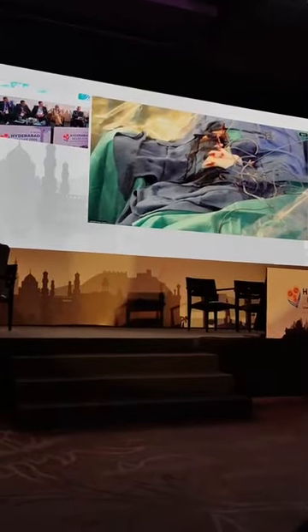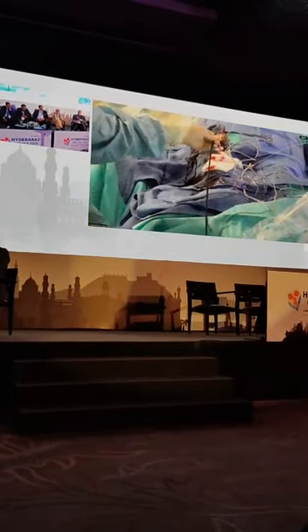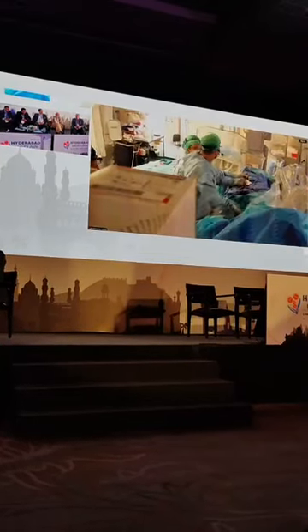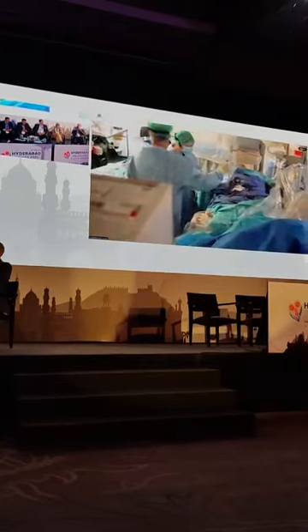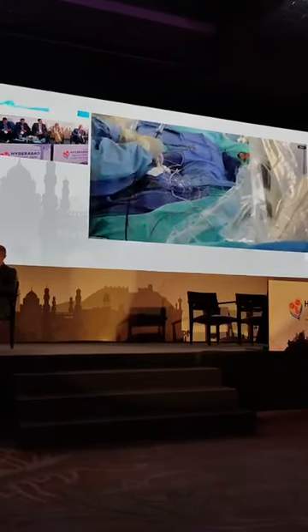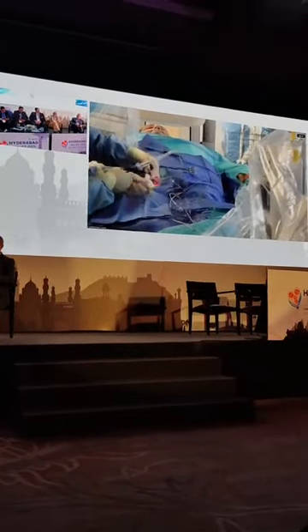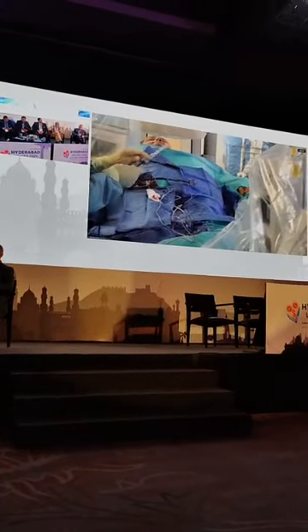So Virginie is advancing the valve. Each time we change our gloves before valve insertion, because you know it's a bioprosthesis. We don't want to add any risk of endocarditis in the future, even though we know that the risk of endocarditis in the future is equivalent to that after surgical bioprosthesis. But we pay a lot of attention to that. It's also important to be quite fast, not lose time, because each time you take time, you increase the risk of infection. So Christophe will show you the device.